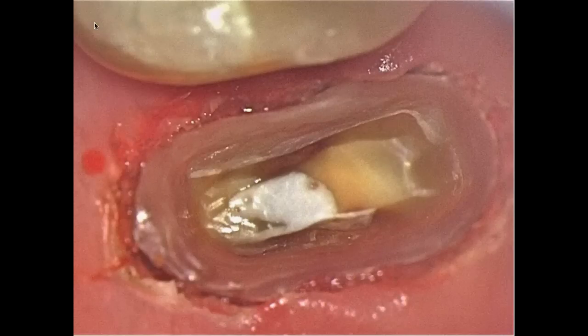Okay. Another question regarding the learning curve. Do you have any tips or tricks to maybe accelerate the learning curve? Yes. If you, for example, do a filling on an upper, you should start with the upper 5 or 6 over the front tooth, because it's easy to work in the upper jaw in the beginning. And then you should mark, for example, the buccal cusp with some color, so that you always know where you are. Working with a mirror turns everything around, and when you mark it, you know exactly what you are doing, and then there you are with your instruments.